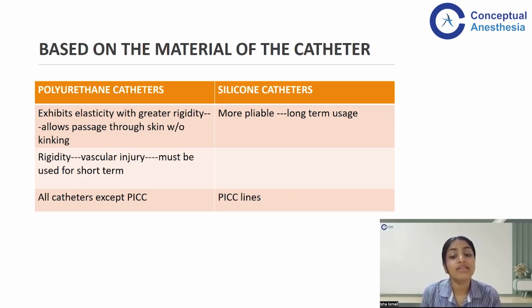The silicone ones can be utilized for a longer term because they are more pliable, they do not cause vascular rigidity, and that is why PICC lines are used for those situations.